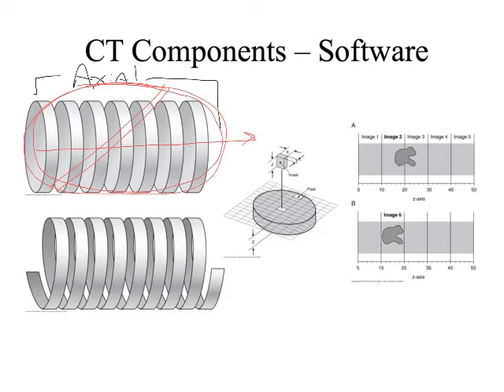The problem with that from a radiation therapist standpoint is, if you can imagine, there's no way that I could ever treat a cancer if I'm just going to have little tiny slices. Like a slice through the prostate, right? I've got to make a treatment plan for this slice, and then it's unrelated to the slice below it. You'll drive your dosimetrist crazy. I just know it because I'm speaking from experience.